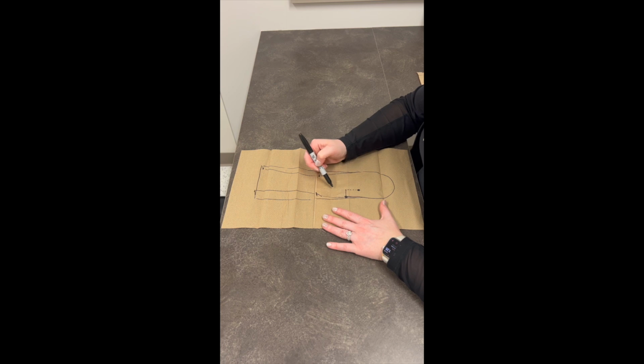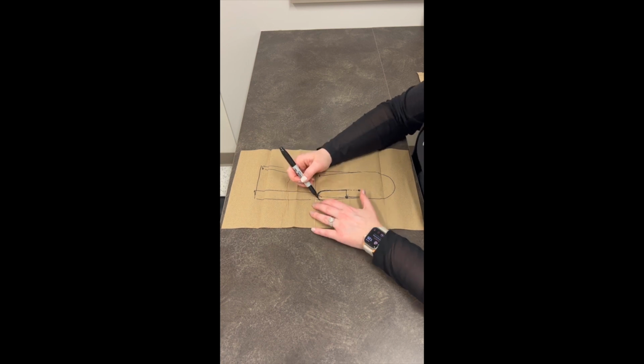Now we're going to draw our cutout. So the thumb portion is going to come down, and then we're going to stop when we get to that landmark that we marked at the smallest portion of the wrist. So that will be our thumb cutout.